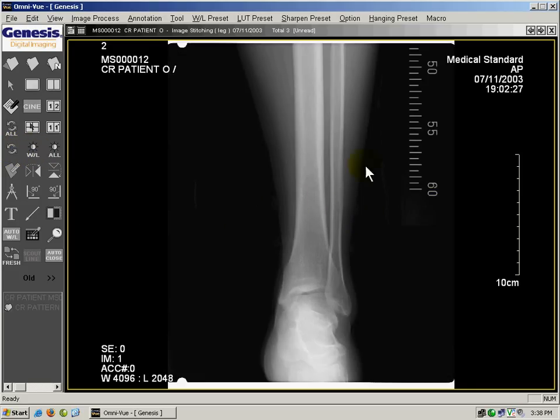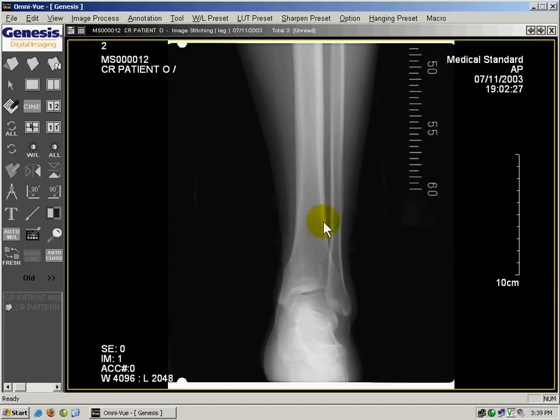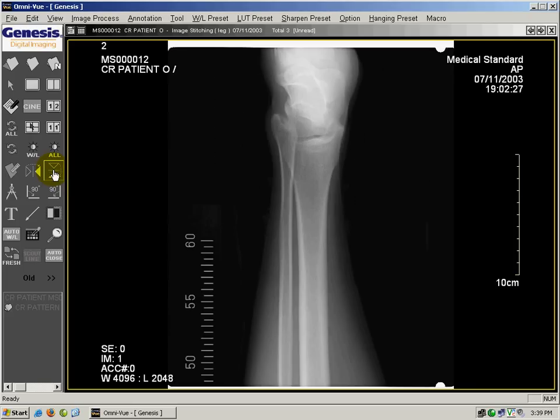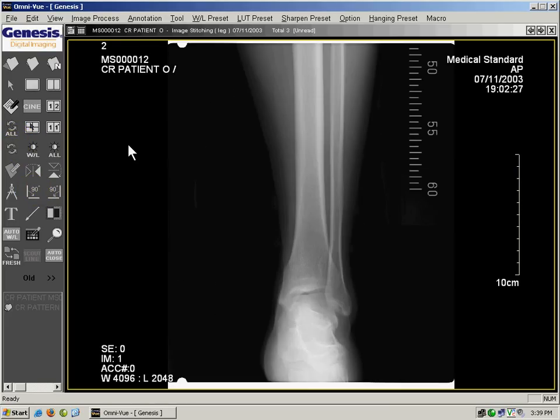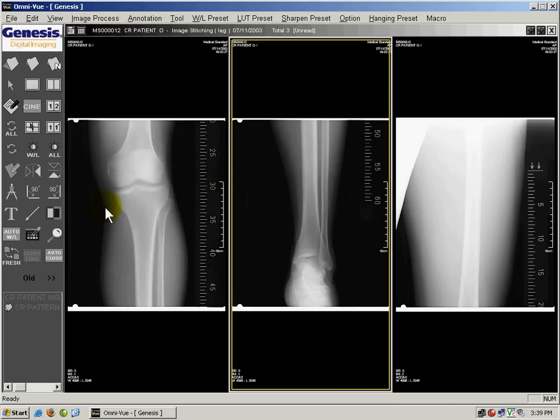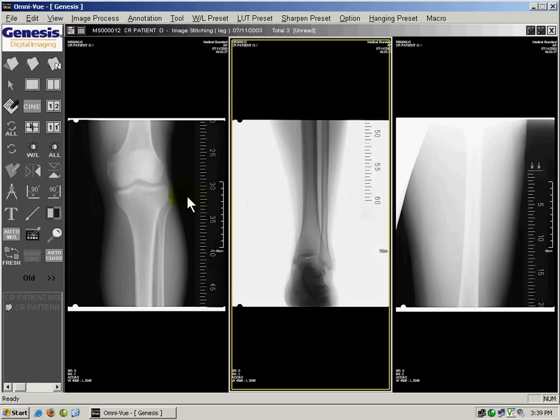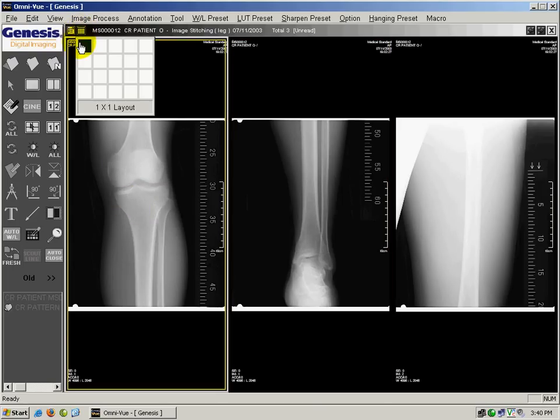You can flip an image by clicking on it first — you can see which image is highlighted by the yellow highlight around the image, and you'll know that image is selected to do the following functions. Here you can flip it horizontally or vertically. You can also rotate the image. You can also invert certain images. Then I'm going to bring this back to one by one.